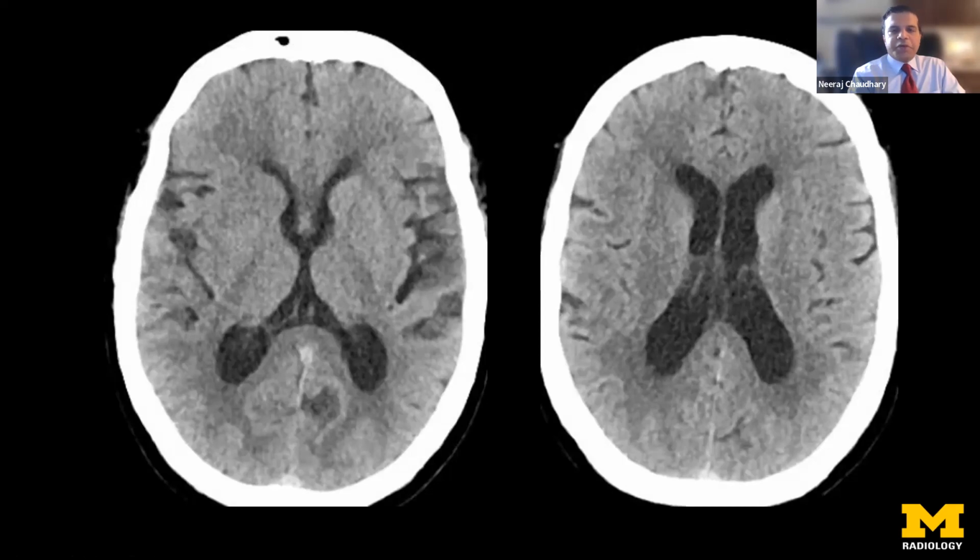What can we do? How can we salvage brain that is not affected? Here, it's starting to have an effect in the basal ganglia. So this is what is evident on the non-contrast CT head, which is very, very important. It gives you some stratification of, okay, there is no hemorrhage, there is a large vessel occlusion, how much brain tissue is already damaged and how much is at stake. That's the core and the penumbra, as we all hear about in acute ischemic stroke.